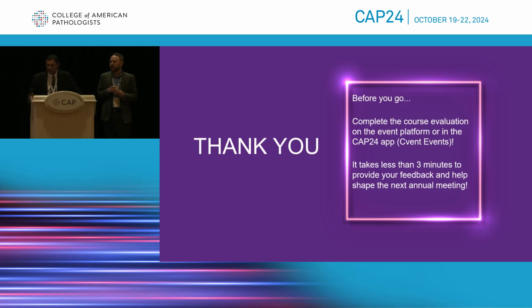With the neuroendocrine carcinomas, I've had many cases which don't have an RB loss, as you mentioned. Interestingly enough, things that do help are sometimes SMAD4. I've had a few cases of neuroendocrine carcinomas that have SMAD4 loss and CDKN2A loss. That's also been helpful. But the problem with CDKN2A and P16 is that you can sometimes see P16 loss in neuroendocrine tumors. Just be a little careful of that stain itself as well.